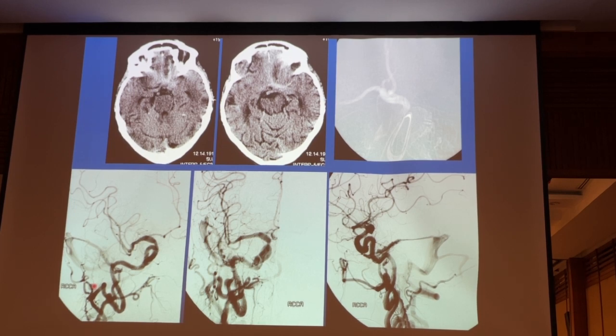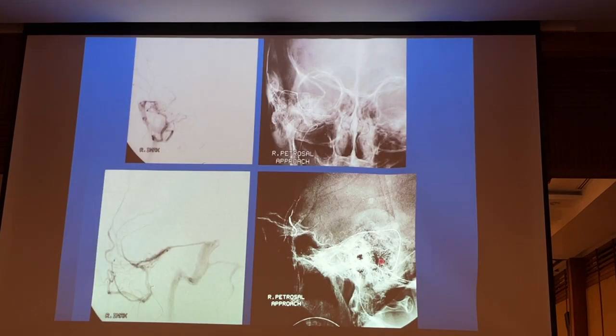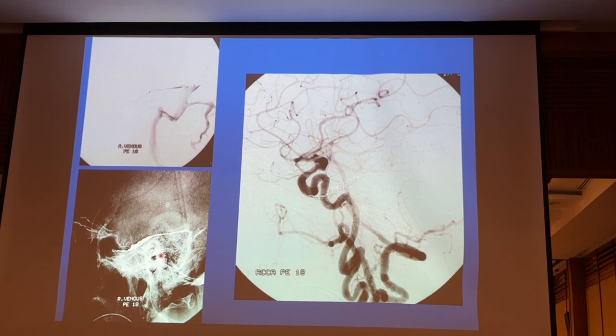So this is how you can see the jugular vein, sigmoid sinus, okay, going through the superior petrosal sinus and the middle cranial fossa. So that's what we did. We got into this shunting area, and we were able to close it with just the venous approach and putting a few fibered coils in there.